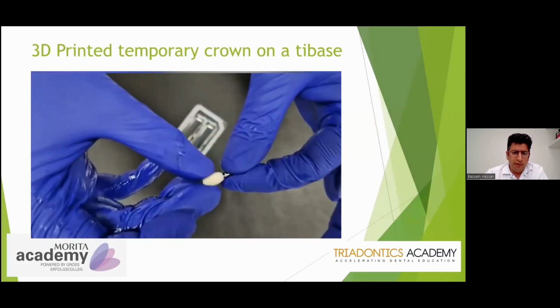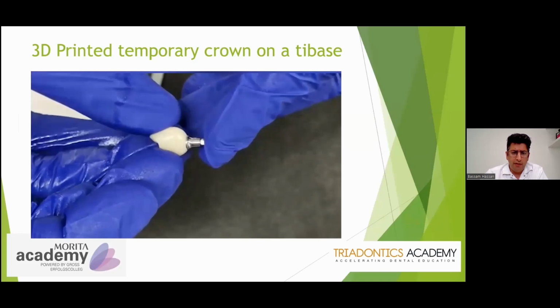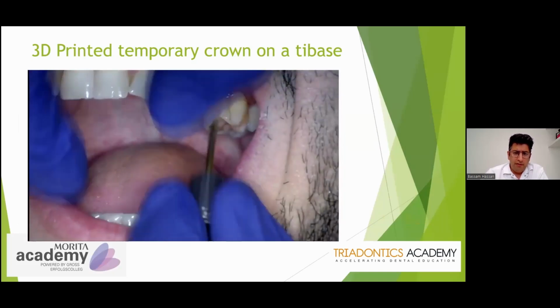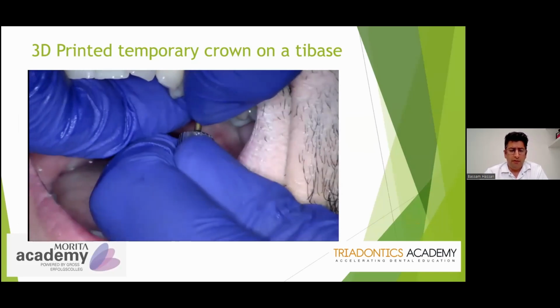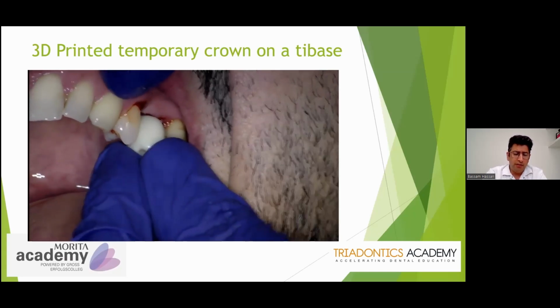And you can print a crown. You have a Ti base. You cement it, glue it together, and it fits like a glove. Fits perfect. And you can go to the mouth, and you can insert the restoration. So, same day partial cases.